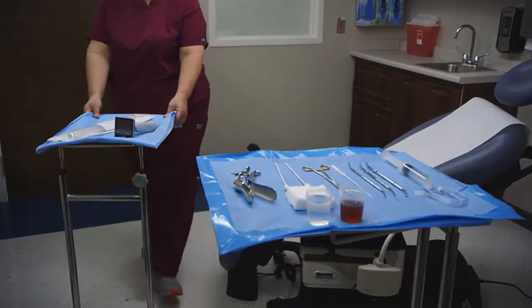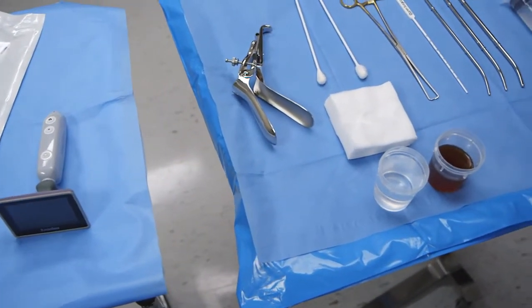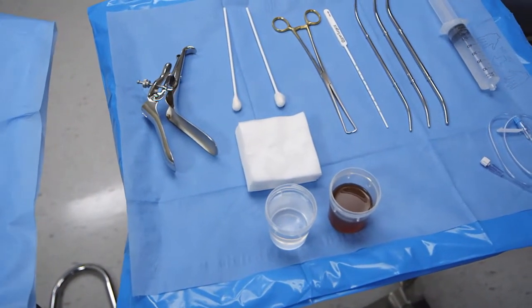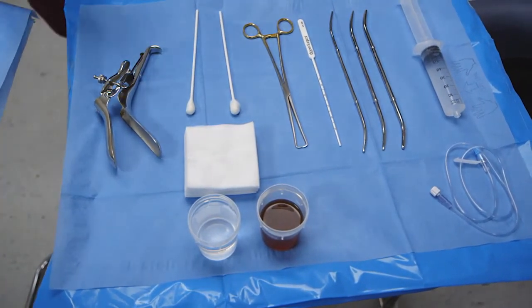Setup for hysteroscopy in your office is simple and quick. In addition to the EndoC system itself, here's what you'll want to have on hand: speculum, dilator set, tenaculum, uterine sound, gauze, betadine, and sterile saline.